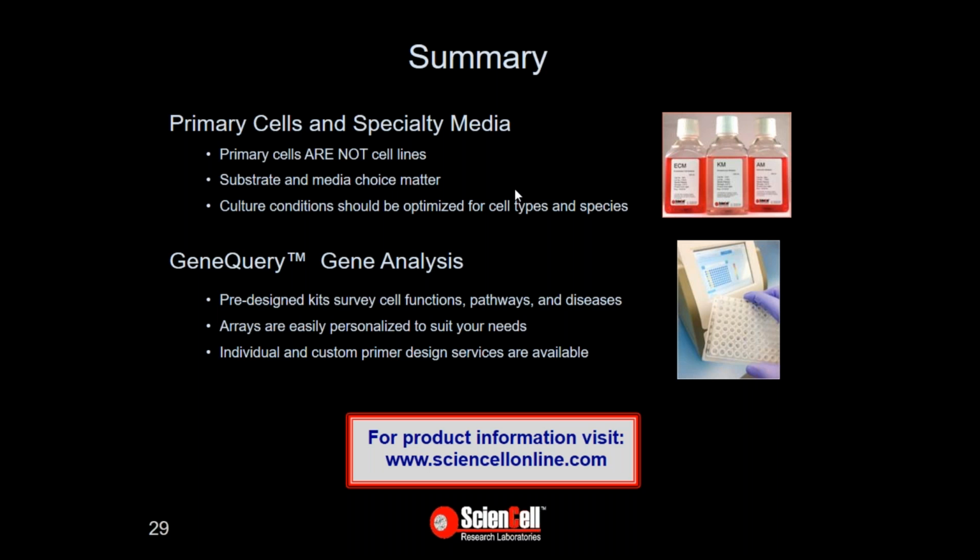So they're susceptible to shear forces and mechanical impact, and centrifuging them can squash them basically, or it kills them. Whereas the DMSO, they're kind of used to it, so they'll deal with it for the 16 hours or so that it takes for them to settle and for you to change the media.